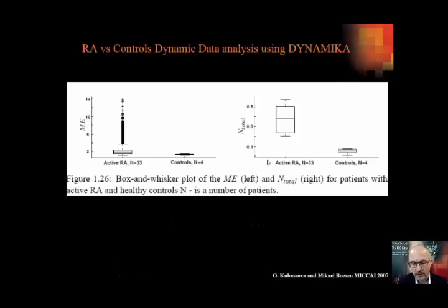One of the good things about this approach is that, for clinical but especially at this moment for science purposes, you can extract measures of disease activity, both the volume of enhancing voxels and the behavior of every voxel, to give you a more dynamic and patient-specific inflammatory load than the conventional scoring systems would allow you to do.